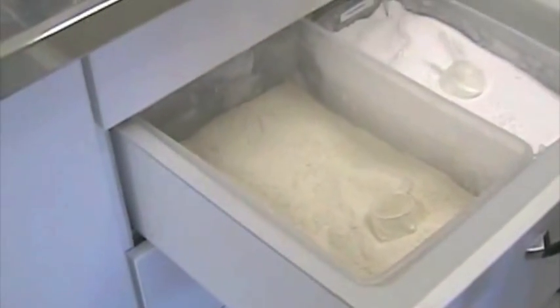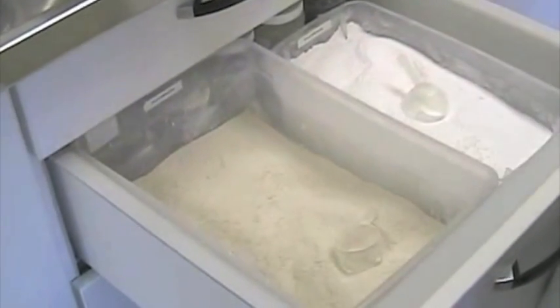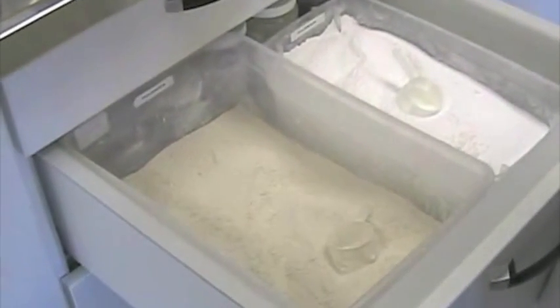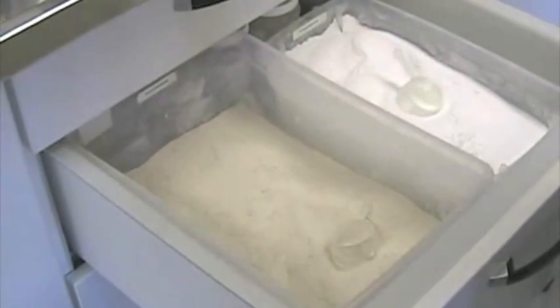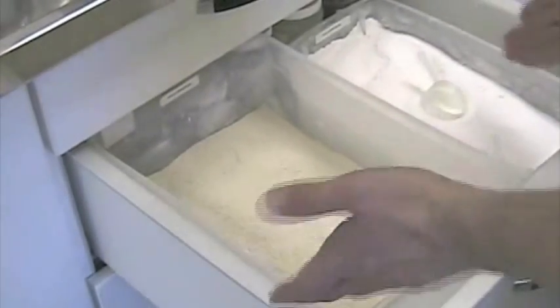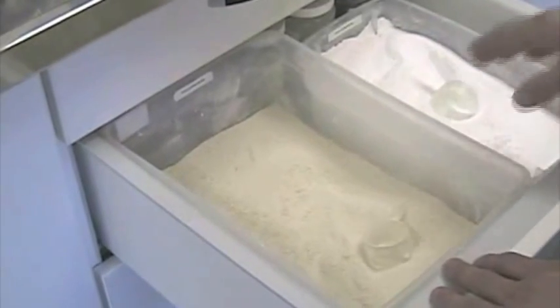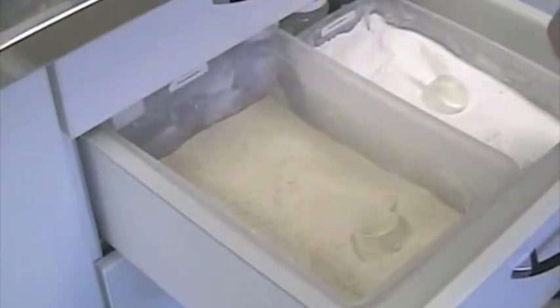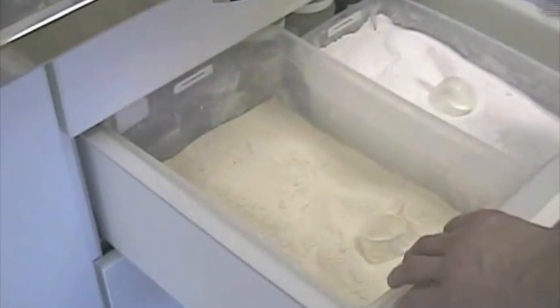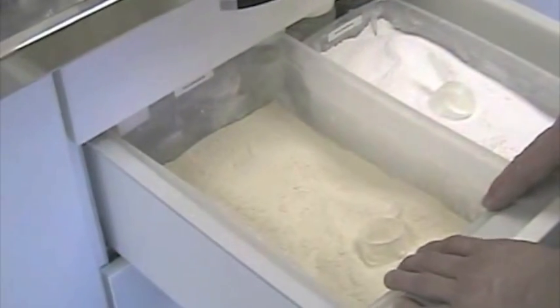We are ready for the pour. I'm going to prepare the stone. I use a type 4 stone. A little advertisement maybe for our friends from GC — I like the Fuji Rock. It is the stone of my choice, the one I have been using for years. It has the right strength, the right hardness and the right expansion, and also the right color. My two favorites: I use the golden brown and the pure white. We can mix them or we can use just the brown alone.